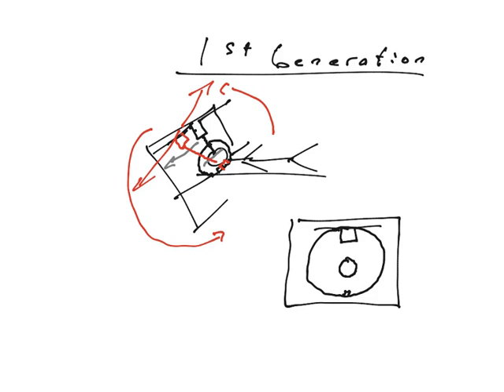And so, as I said, this generator and detector attached as one would slide to the left, sending the beam straight through until the detector and the generator are over here. Then this part, the circular part, would rotate a little bit and then slide back that way, and so on down the line. Back and forth, rotating around a full 180 degrees.